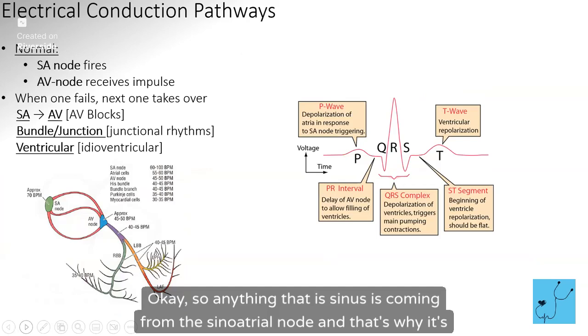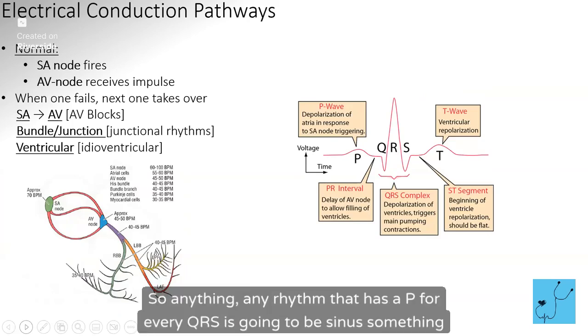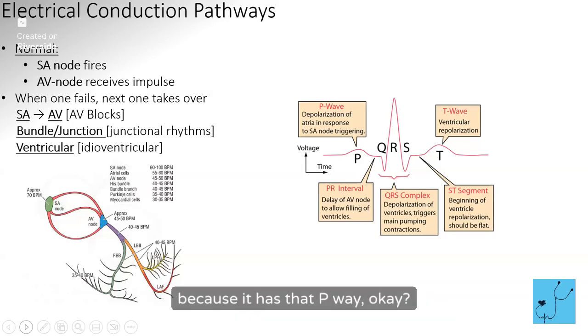sinus is coming from the sinoatrial node. And that's why it's called sinus. So any rhythm that has a P for every QRS is going to be sinus something, because it has that P wave, okay?